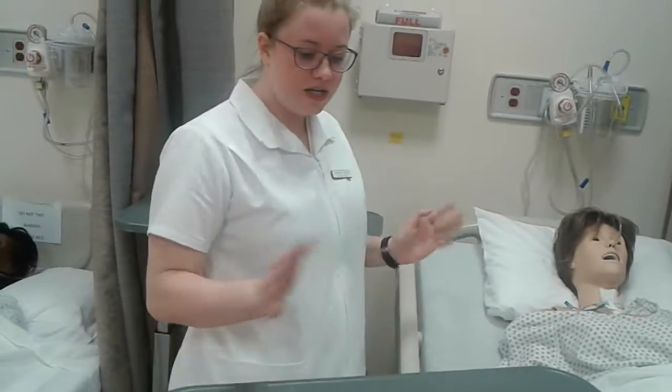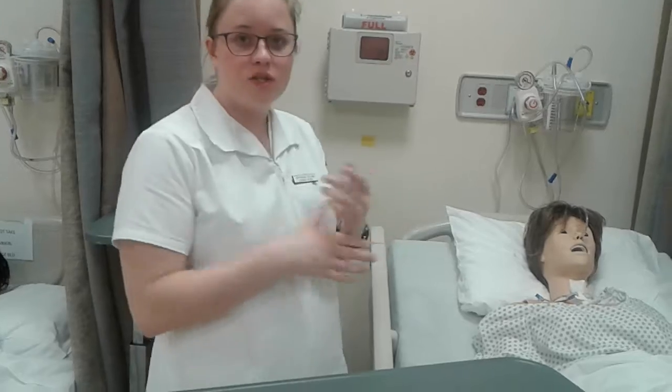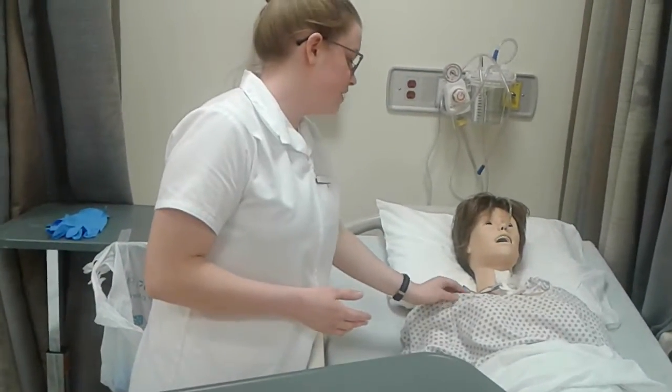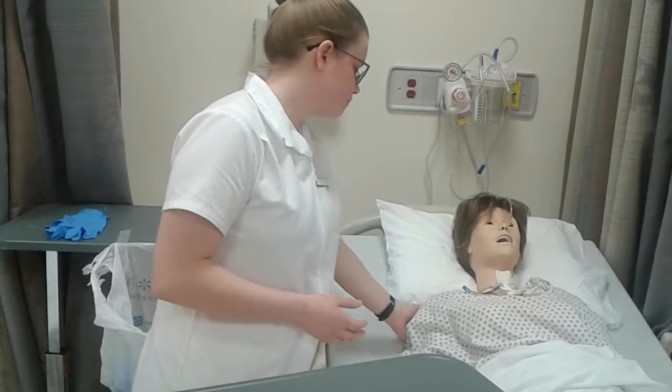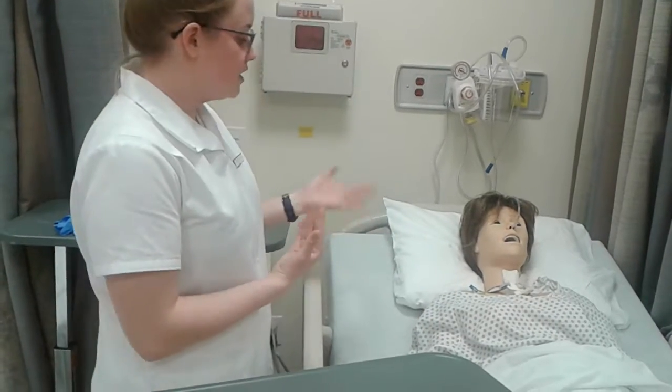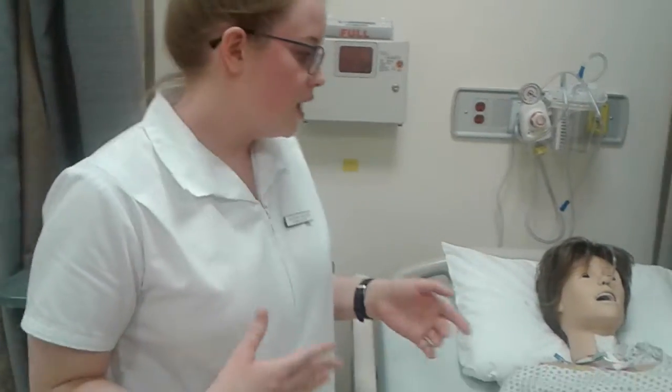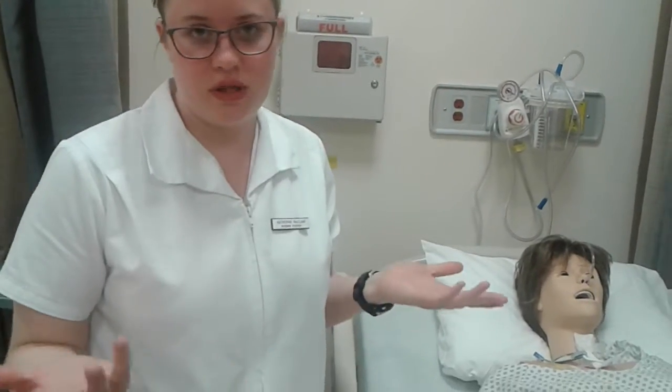Before I start, I would sanitize my work surfaces, wash my hands or use hand sanitizer, and I would drape the patient, exposing only the central line site. So now that I can see the central line and the old dressing, I would assess for any signs of redness, swelling, irritation, or infection, and I would also assess her comfort level.